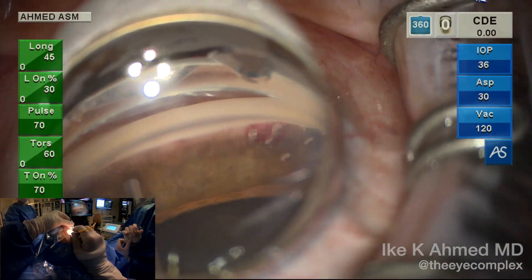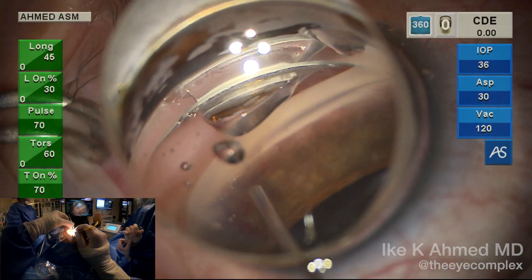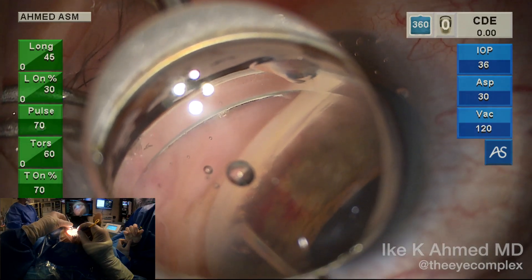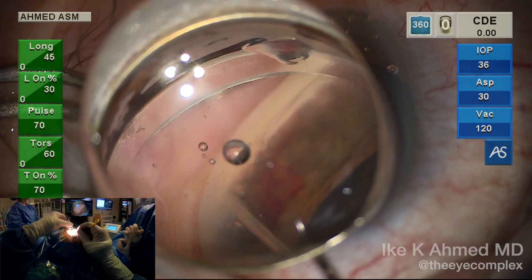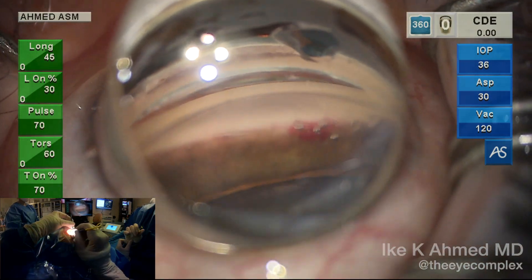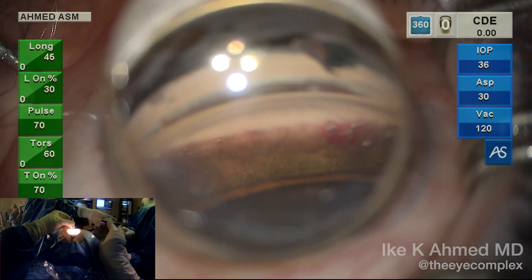This allows for coaxial placement and adequate ostomy formation. We have ten shots, about one tip diameter apart. We'll do one more in the infranasal quadrant, as this is of course the most important quadrant to hit, considering the abundance of aqueous veins in that vicinity. We have now performed ten shots over the infranasal and nasal angle.